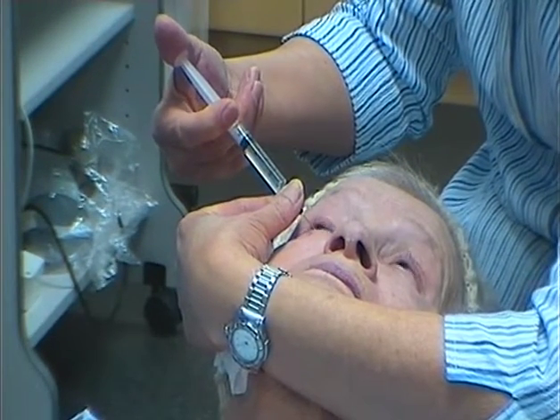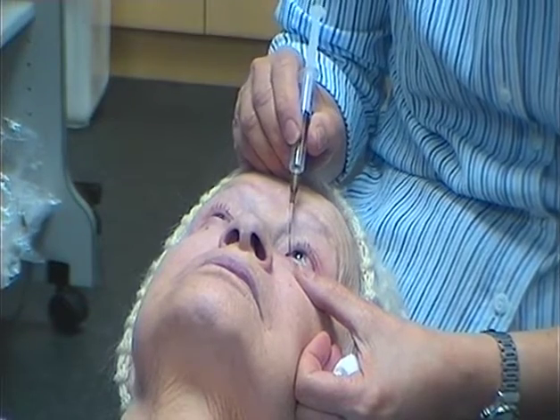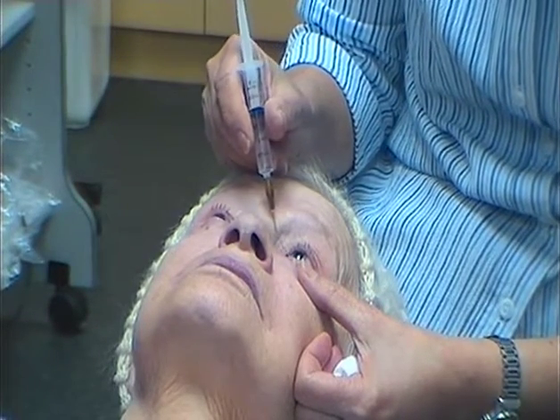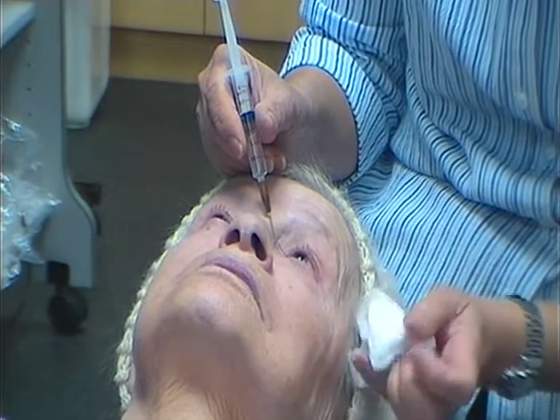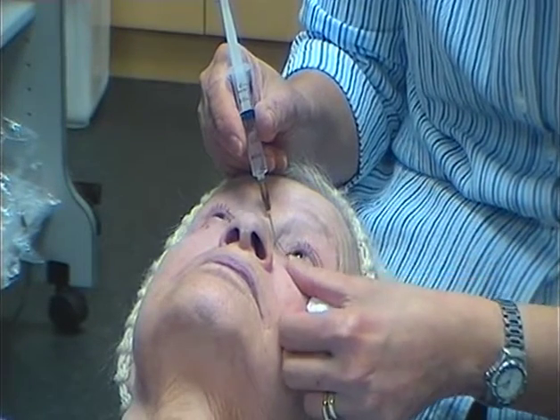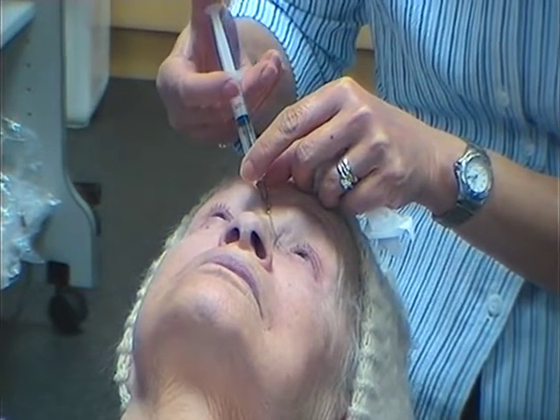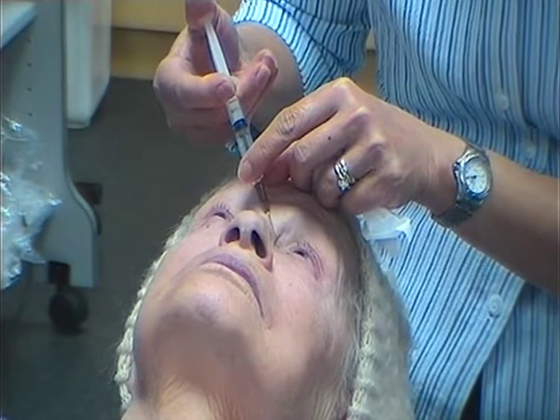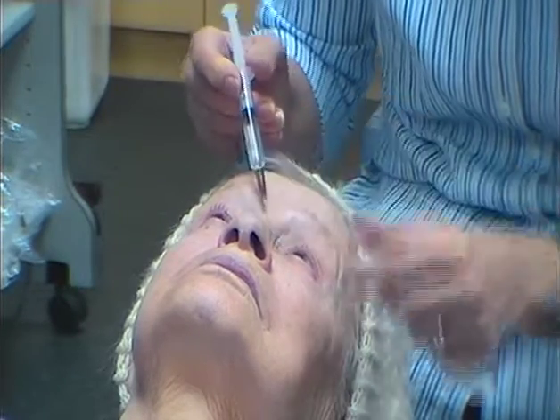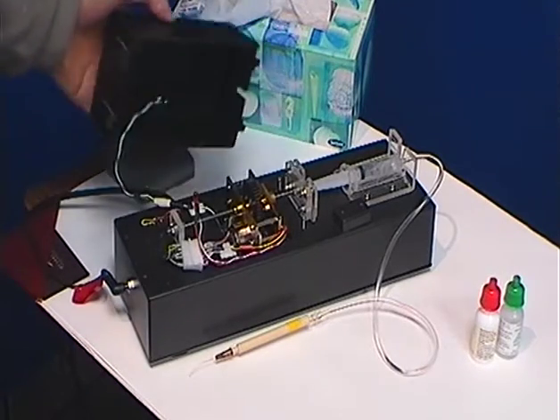This is one of our senior nurses as she routinely syringes a duct, and what I want to illustrate here is the way in which she has to reposition her hands on the syringe in order to inject the saline. And this is the other eye, and again it's apparent the general procedure is awkward in that, having placed the cannula, she then has to change hands in order to inject the saline, and the whole procedure is remarkably inefficient.